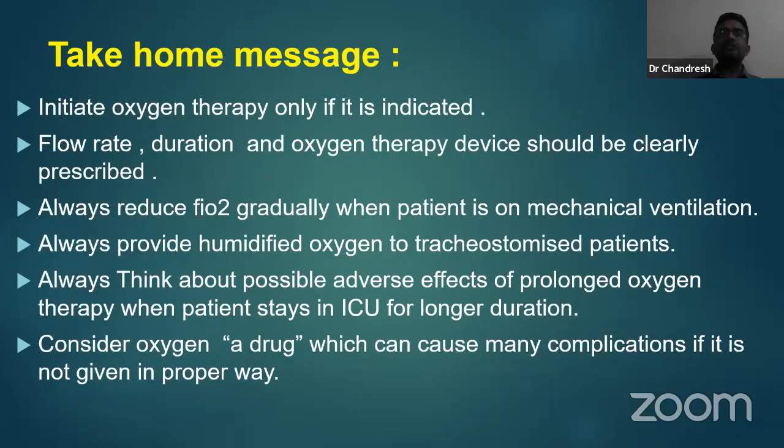Yes, if you are using a very high flow, like 15 liters, 18 liters, 20 liters, a patient can have dryness of the nasal mucosa, they can have bleeding, the secretions might get crusty, and the patient can have airway collapse, and bronchial secretions can be blocked in one of the bronchi. The patient can require bronchoscopy as well.